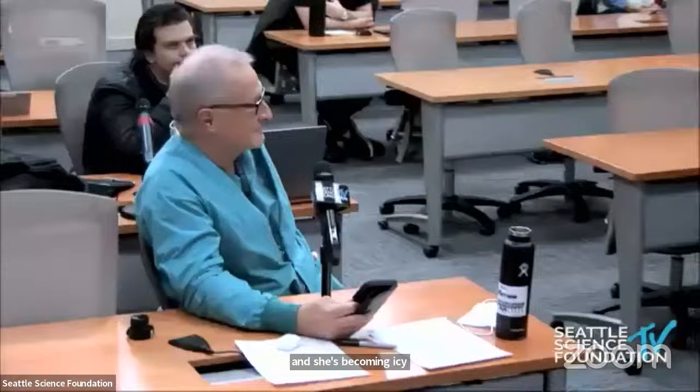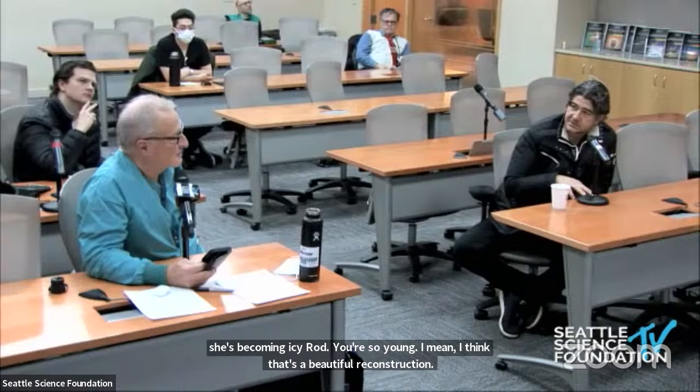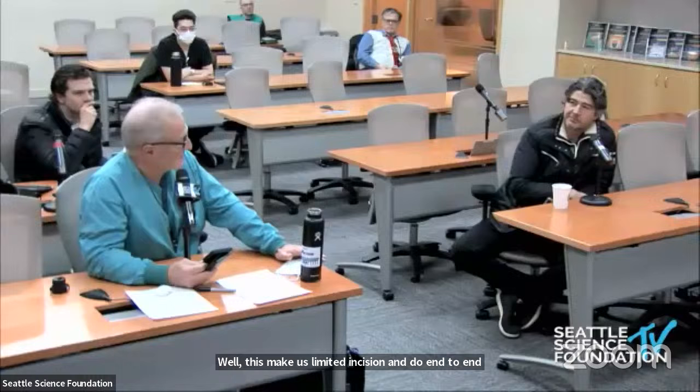And she's recovering nicely. Rod, your thoughts? So, Jens, I think that's a beautiful reconstruction. What were you saying, it's staged? Yeah, we will do the thoracolumbar spine. How are you going to connect the two? We'll just make a limited incision and do end-to-end connectors. This is a dual core rod system, so we have nice end-to-end connectors with that particular manufacturer.